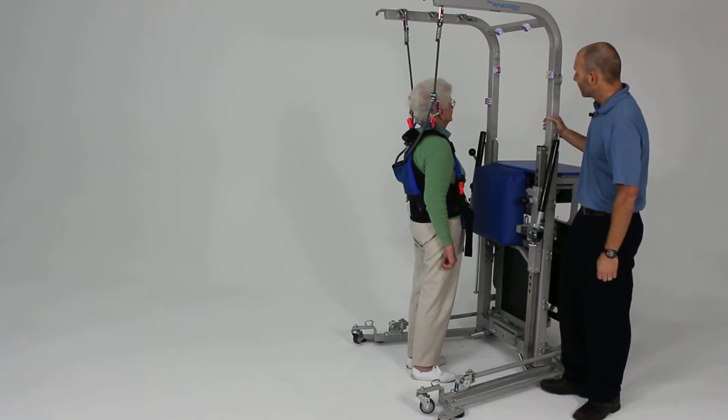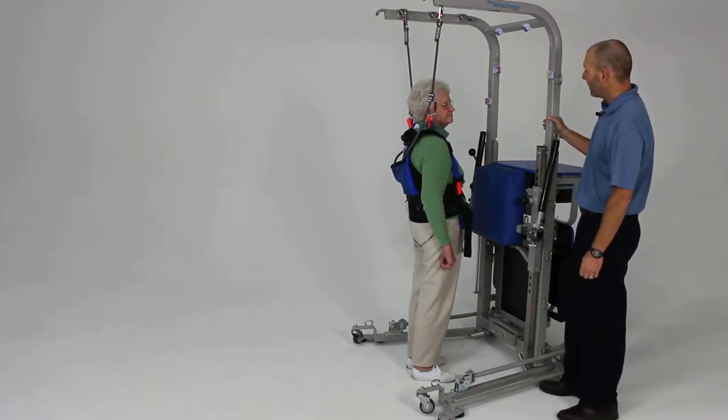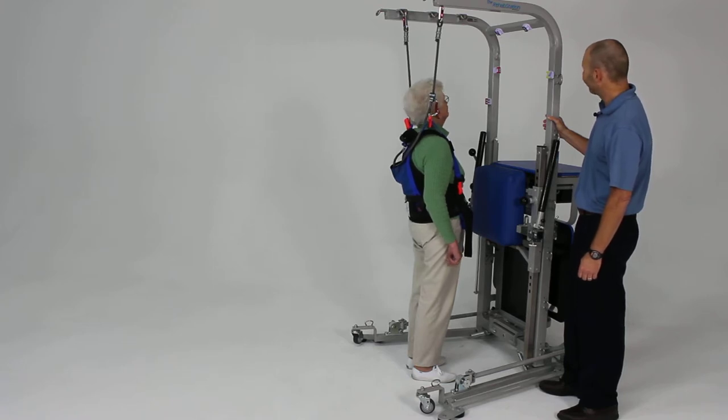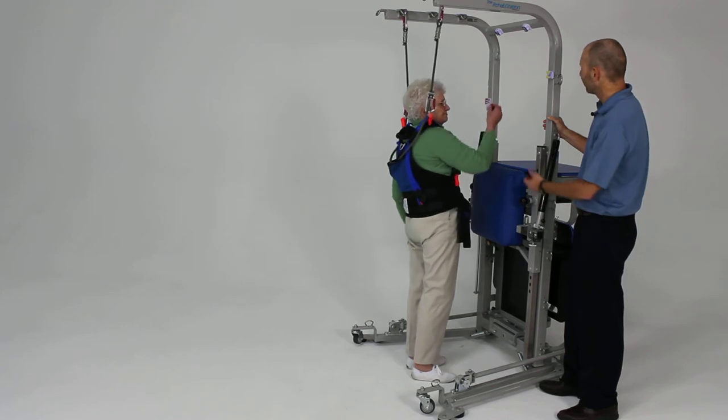We're going to go ahead and have you use your right hand. I want you to first find the I. See if you can find the I and reach for it. Good, okay.